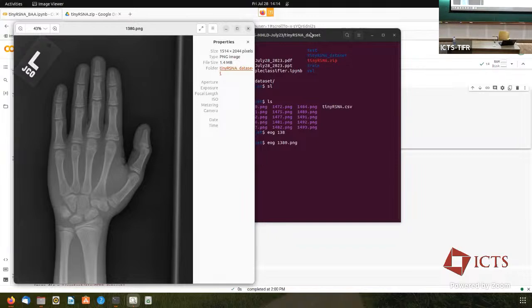Now, are you going to design a network from scratch? Typically, no. These networks have been developed. Some of the old networks had fewer layers, AlexNet and so on. Then came the VGG-level networks. Then came ResNets. And now there's a zoo of networks. So typically, when one wants to use it for applications, one uses the standard networks that are available.